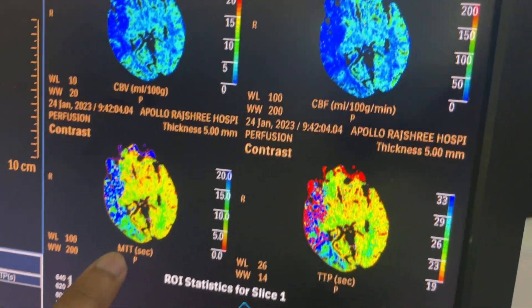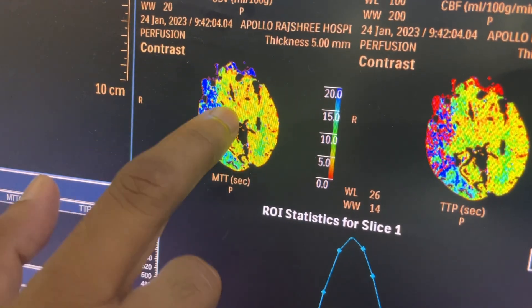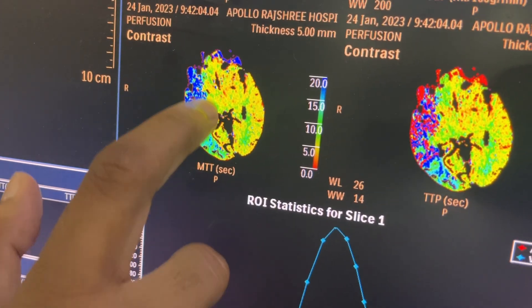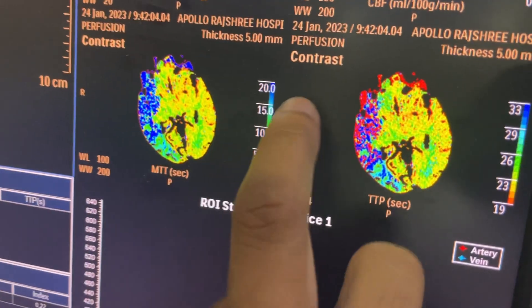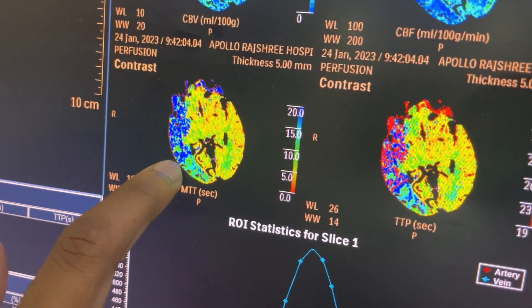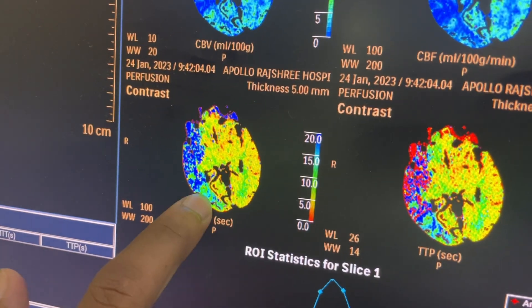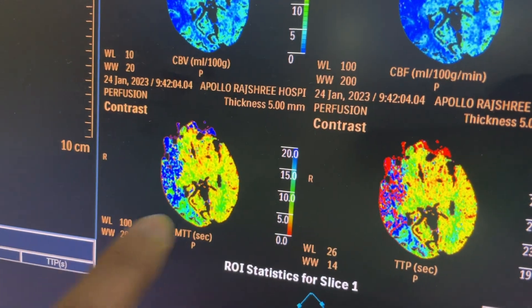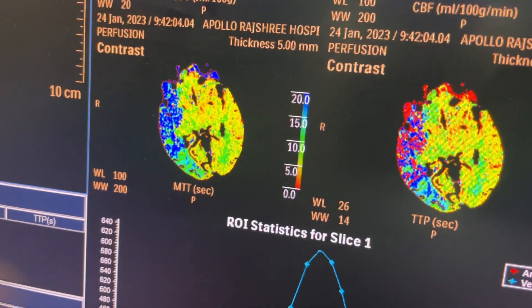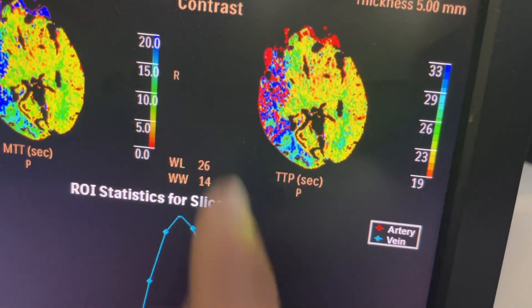Mean transit time (MTT) means: suppose your RBC starts here — how much time does it take to traverse this whole portion of the brain? You can see this portion of the brain is in the blue range on the scale, meaning MTT is high, while the other portion is yellowish-green. A higher MTT means the blood flow is very low, and the RBC is taking a very large amount of time to pass through this part of the brain — meaning it is already damaged.